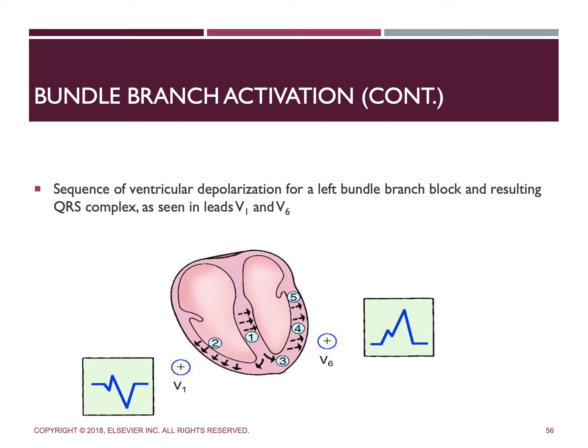Because the wave of depolarization moves briefly toward the positive electrode in lead V1, a small upright notch in that QRS complex is going to be seen on the ECG. As the remainder of that left ventricle is depolarized, the QRS complex is inscribed in lead V1 as a deep negative deflection, so an S wave, for example, which is a reflection of that left ventricle's large muscle mass.